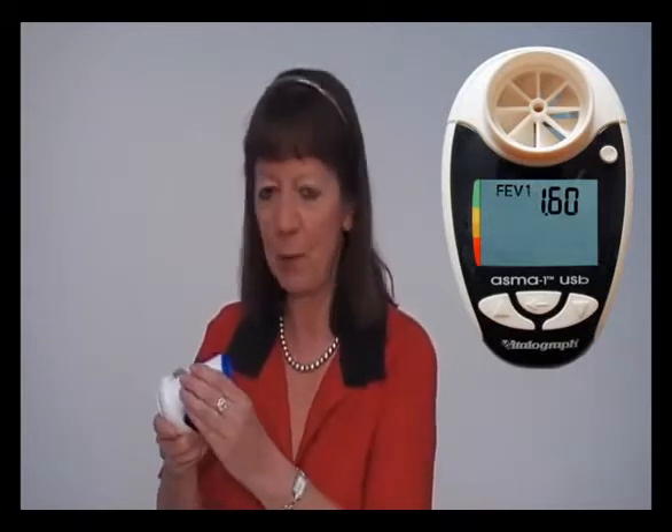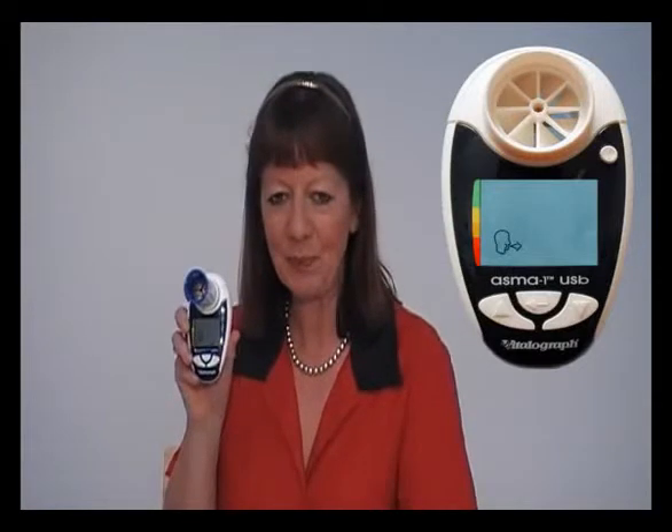Insert a SafeWay mouthpiece and then use the circular button to switch the AsthmaOne on. You're now ready to perform a test. Take a maximum breath in, lightly bite the mouthpiece with your lips and seal your lips around the mouthpiece, and blow as hard and as fast as possible for more than one second.